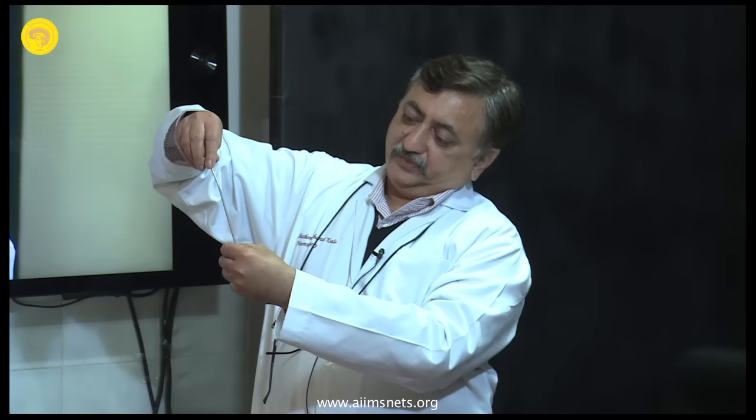Widest screw possible, 7 mm, 6.5 mm. And the length depends upon how far your promontory is. You have to check that on X-ray. You see, there are some principles. There is no hard and fast rule.